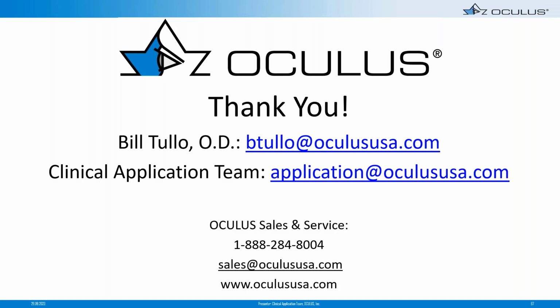That's great. Thank you, Michelle. That's a really good technique for anyone looking to improve their scan tips. I do have one final question for you both, the hardest of the hardest. How does the time of day affect the scans? Because the human body is not a static thing throughout the day.